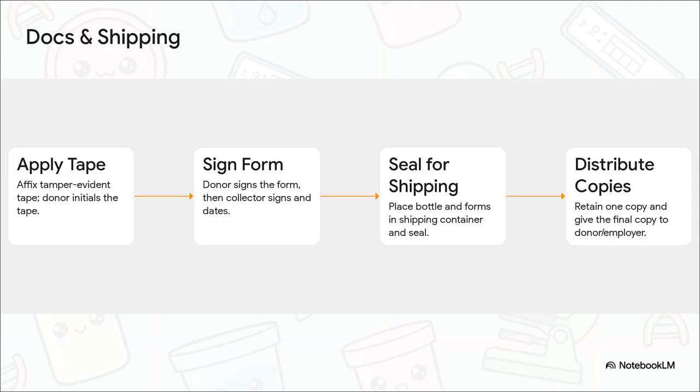It's their proof that they saw you seal their unaltered sample. Then, you both sign the form. Every signature, every piece of tape, it's just another unbreakable link in that chain, making sure that sample is secure all the way to the lab.